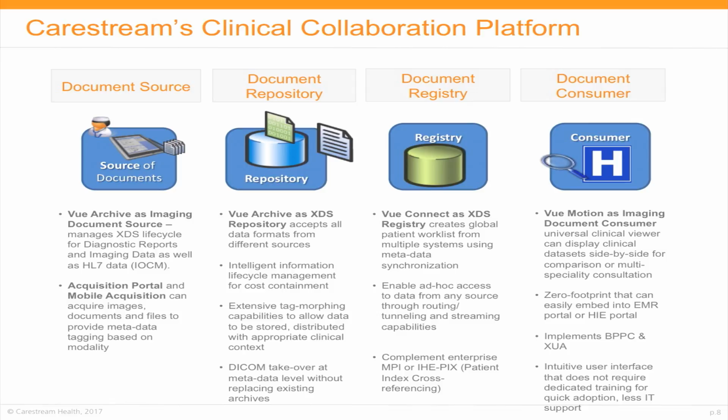It can query and retrieve XDS data and DICOM data as well, and present and display them side by side.